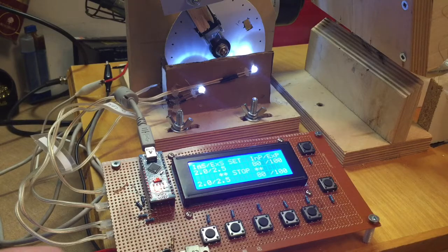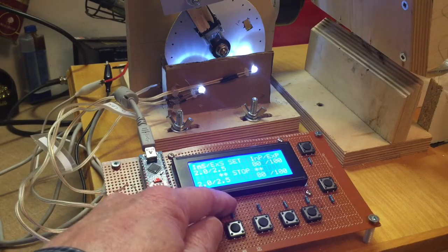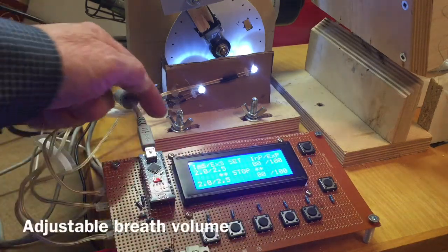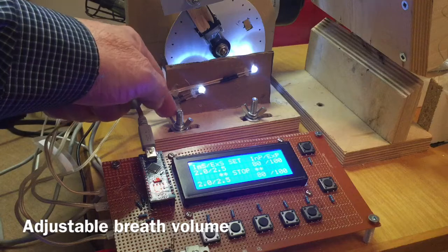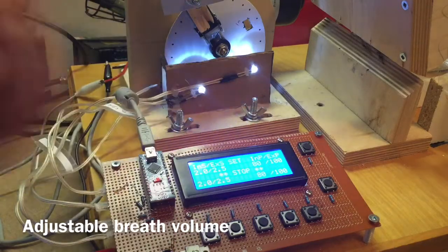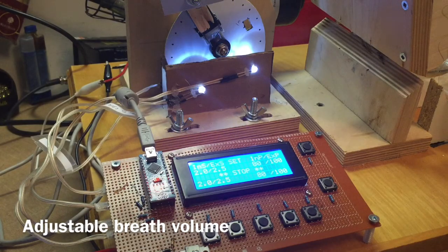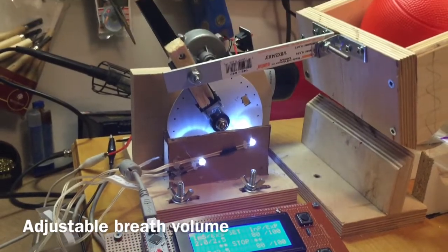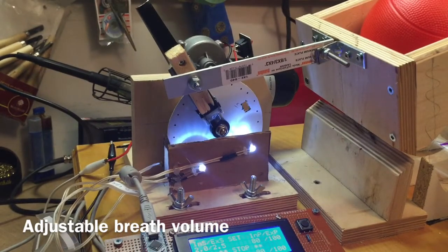As well as being able to adjust the inhale and exhale durations and the inhale and exhale power, you can also adjust the stroke of the machine. You can slide the motor assembly back and forth to either increase or decrease the amount of compression on the bag. So this could be modified to be used for pediatric and adolescent size ventilators. Thank you very much.